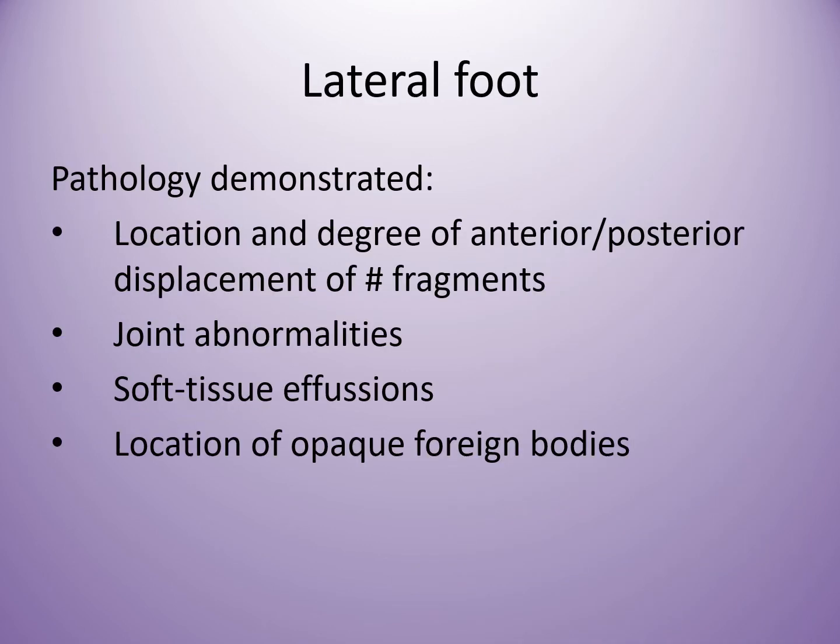Okay, lateral foot a bit more. So pathology demonstrated could be more of the foreign body actually. Lateral foot especially, location of the opaque. Remember what is the difference between the opaque and lucent here? Radio-opaque and radiolucent.